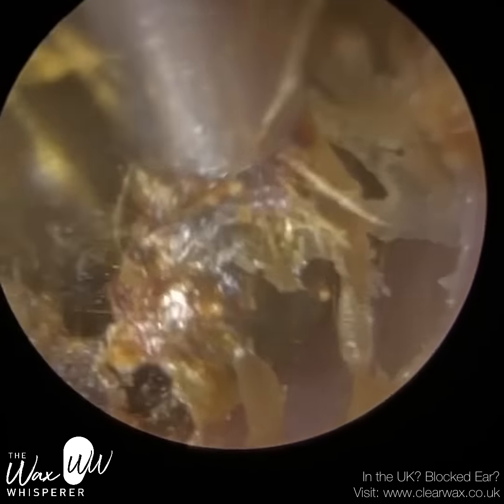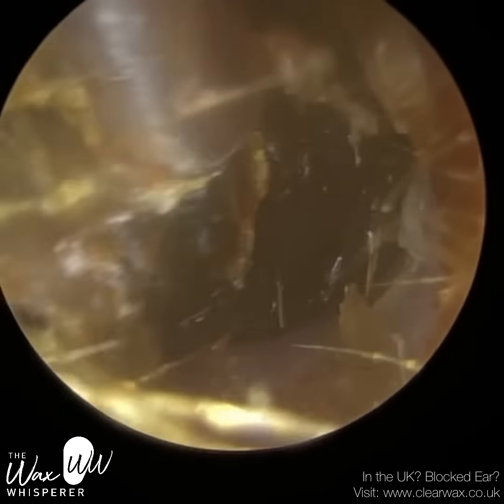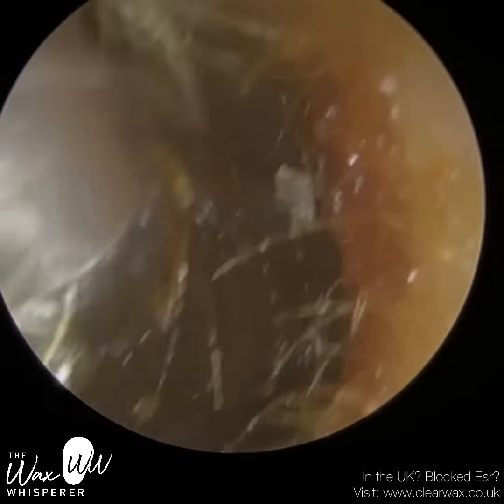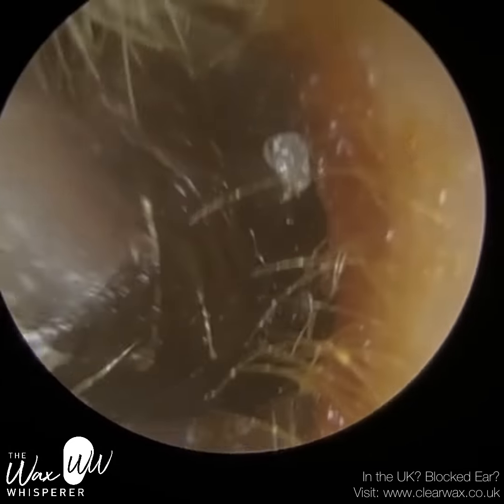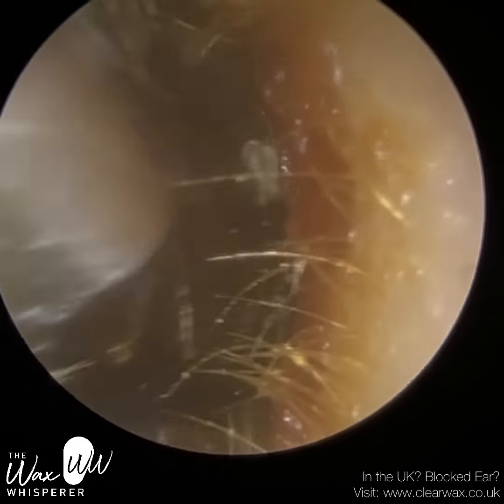This is where an endoscope really provides you with an unparalleled view — we're able to see the whole wax plug within the ear canal. Now I'm using this rocking motion; I've got this suction grip and I'm rocking backwards and forwards, left to right, and we're trying to manoeuvre this wax plug out of the ear.